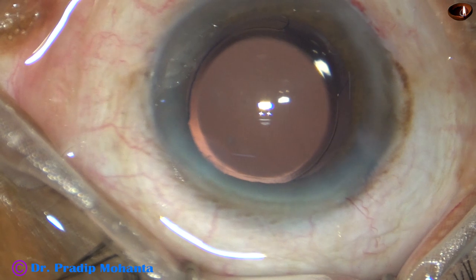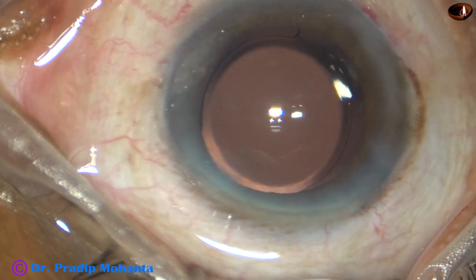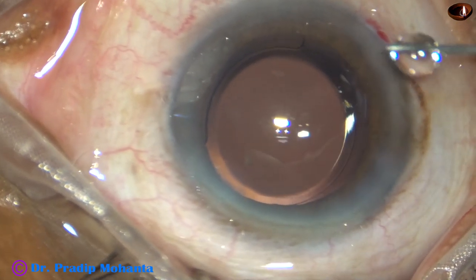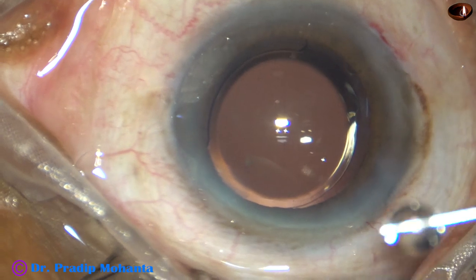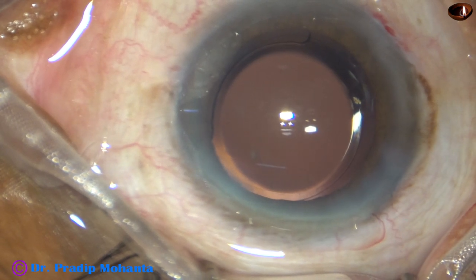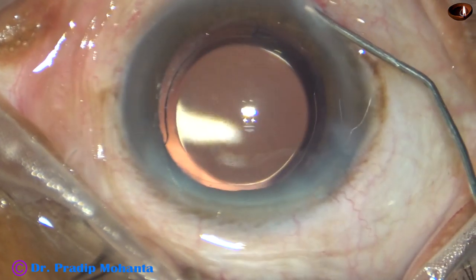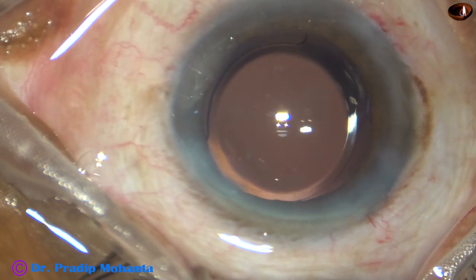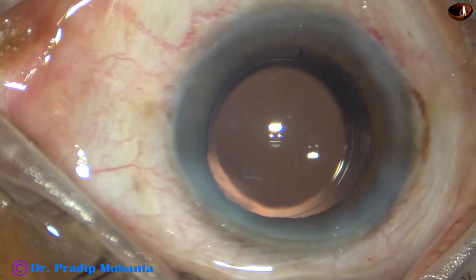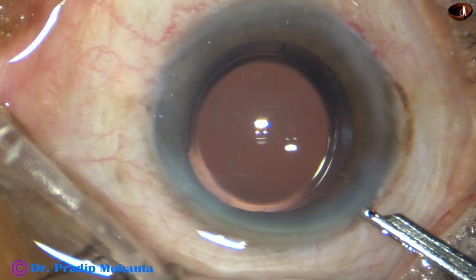We are towards the end of the surgery. This is moxifloxacin. The side ports are closed by corneal stromal hydration — the corneal stroma on either side of the side incisions is hydrated, the cornea becomes thick and the side ports close. The main incision is constructed in such a way that it doesn't require any hydration.